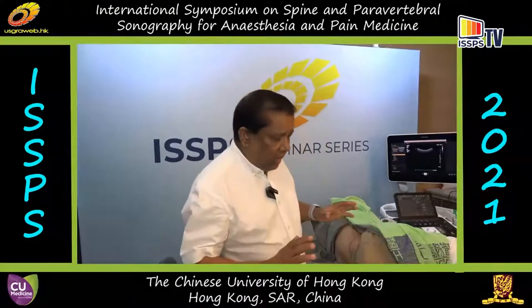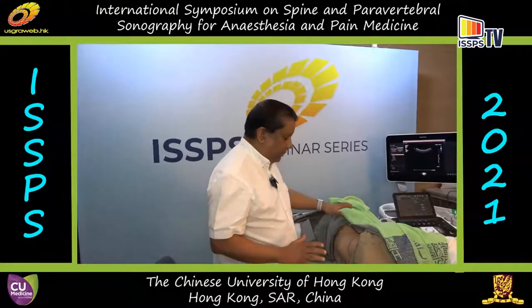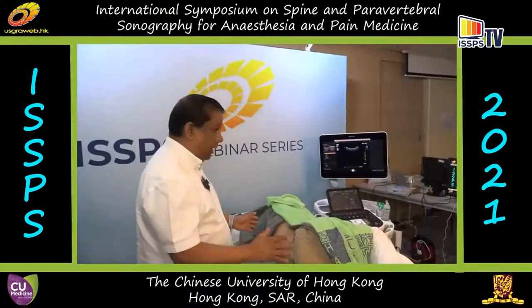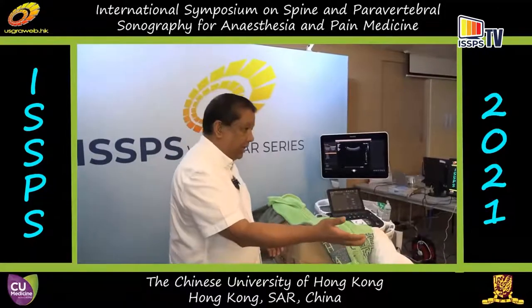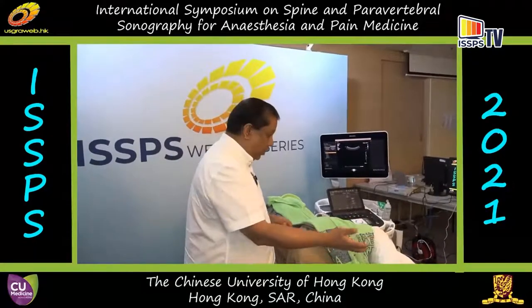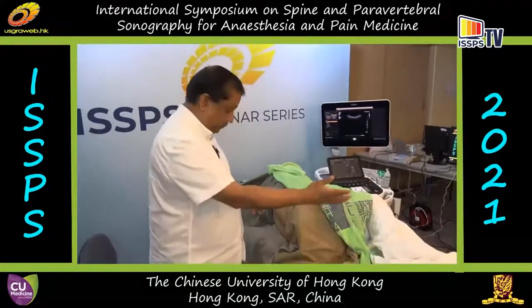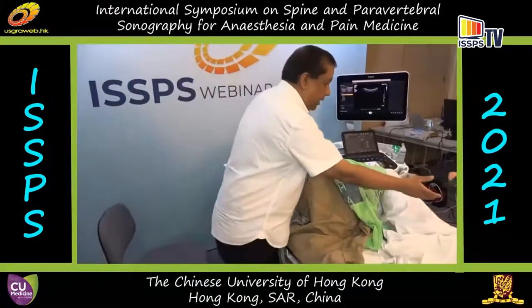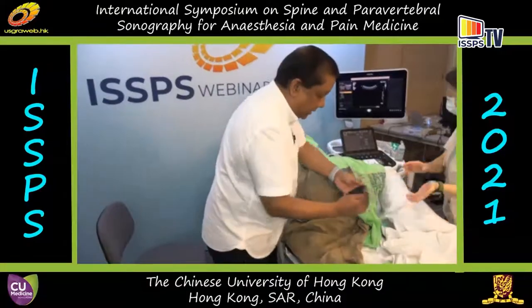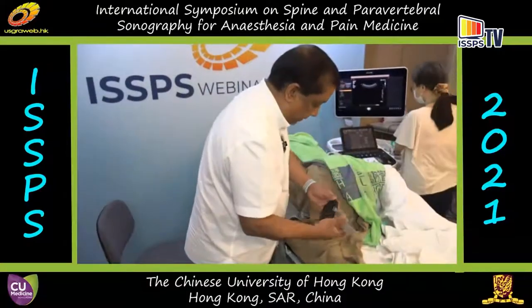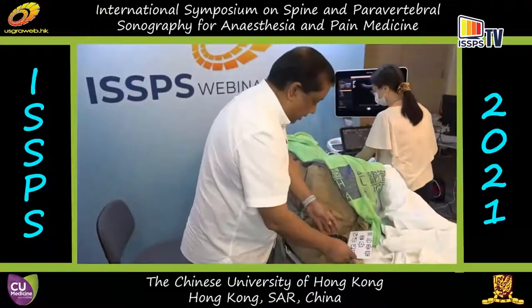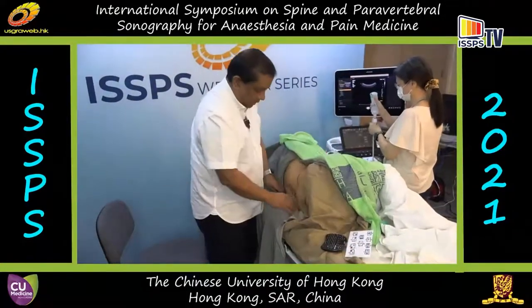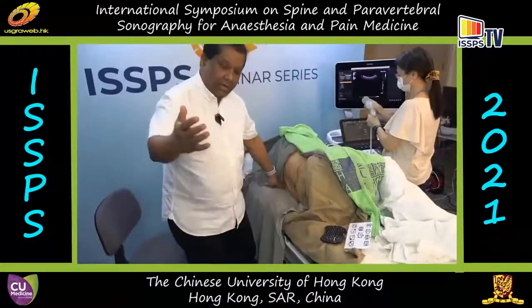When you're looking at real-time scan for individuals and looking at ultrasound imaging, we're looking at the lumbar spine. As you can see here, we are now imaging the lumbar spine.